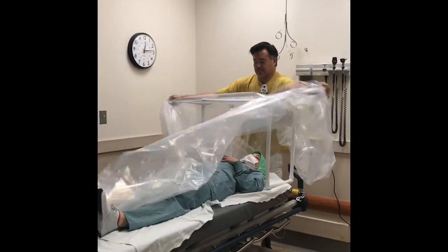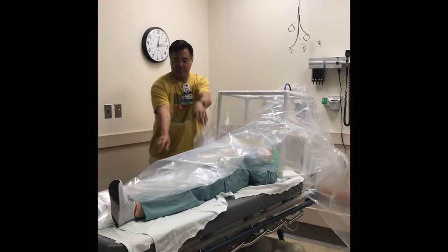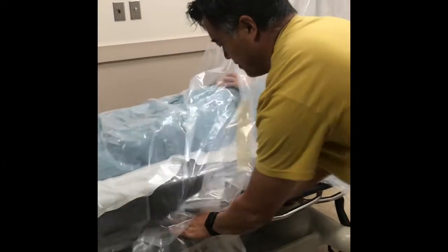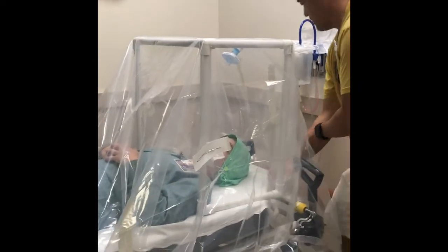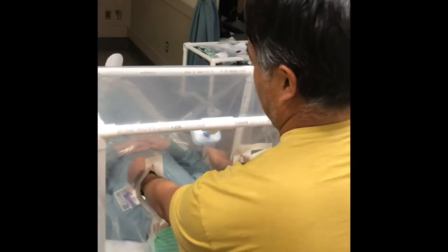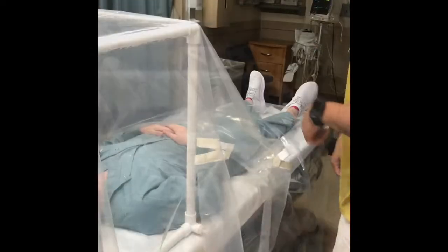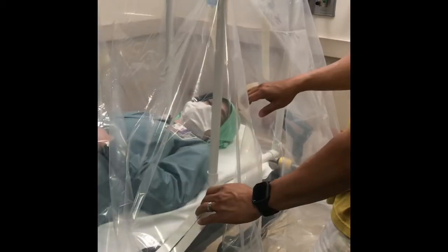At this point, the drape can then be opened towards the patient's left and right to completely cover the patient. Tuck in the drape on both sides of the patient and at the head of the bed, which will improve the negative pressure. You will notice pre-made holes such that intubation can be performed at the head of the bed as usual.